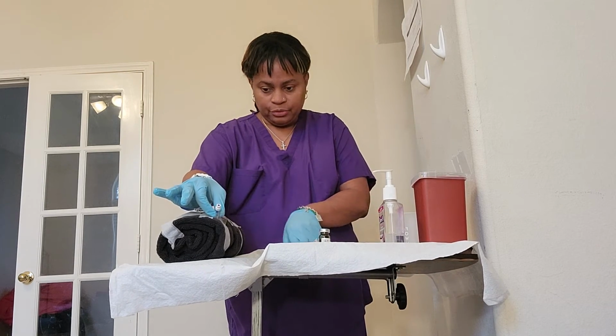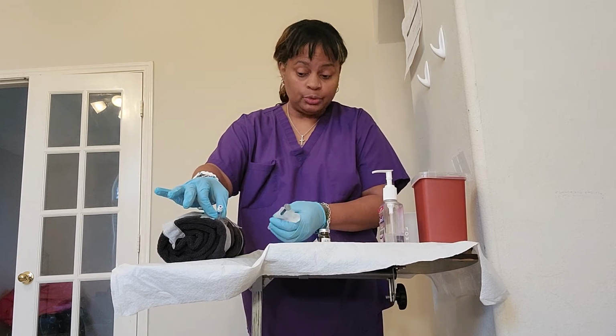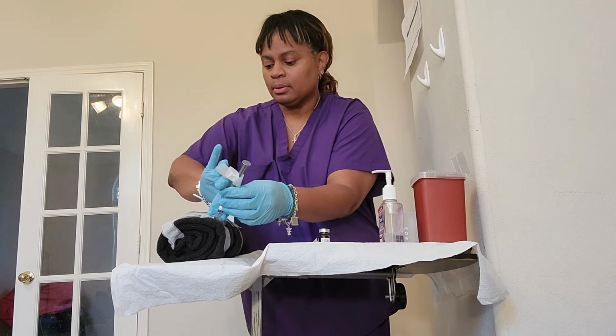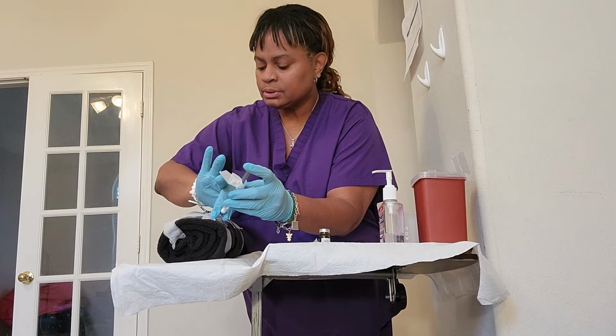Then I'm going to administer this medication, the furosemide. It's 20 milligrams or 2 mLs. And we're going to do it over a 2-minute period, okay? So I'm going to put this right here on the hub. And we're going to start now.